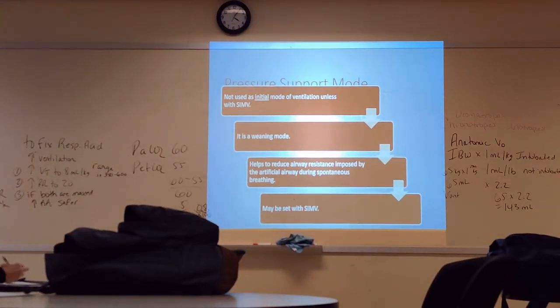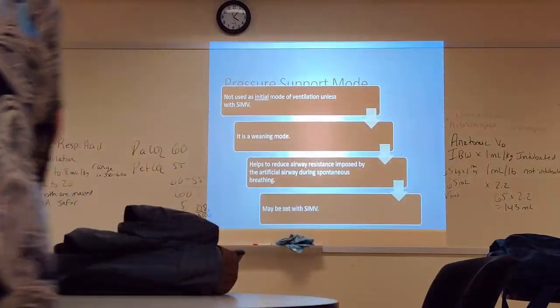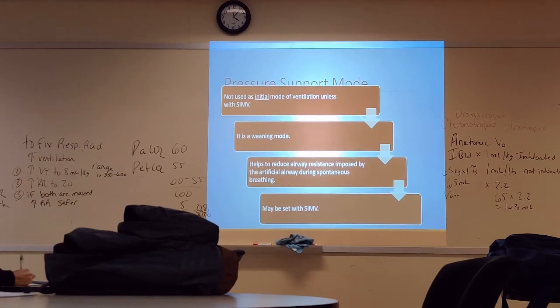Pressure support by itself, so PSV as a mode, is a spontaneous mode of ventilation. Write that somewhere in big fat letters, spontaneous mode. This cannot be used on somebody who is heavily sedated and paralyzed. And again, that should make you go duck. Because you can't separate. Right, precisely. And I will give you an example of that.